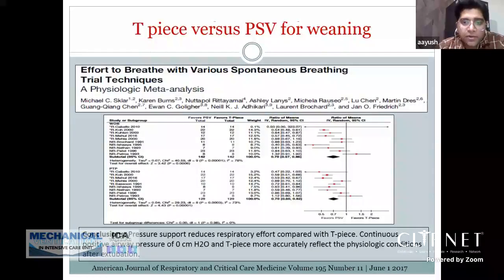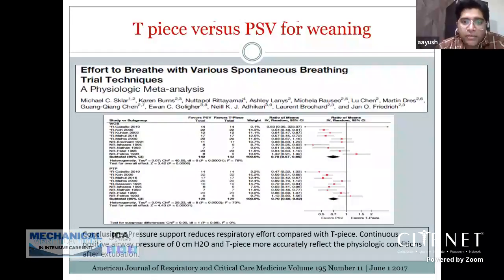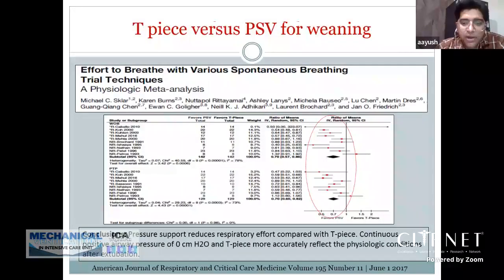To wean the patients who have a degree of LV dysfunction or who have a concomitant COPD, we would prefer to wean the patients on pressure support ventilation as compared to the T-piece trial when they're given SBT. And this is the meta-analysis which showed that giving the patient pressure support will lead to lesser work of breathing and lesser pressure time product as compared to giving the patient just a T-piece trial. And also, these are the subset of patients who should be weaned on an NIV as compared to just extubating them and putting the patients on a normal venturi mask.